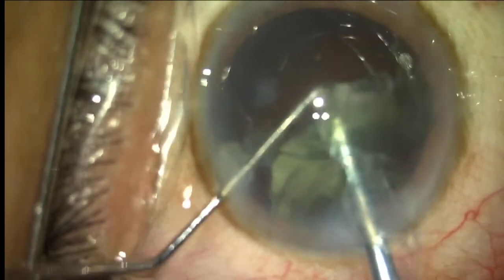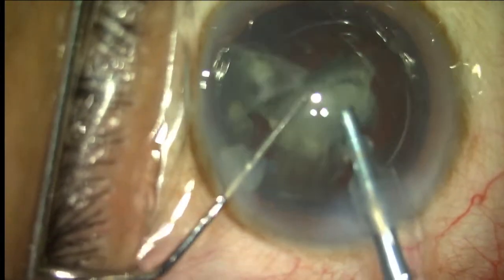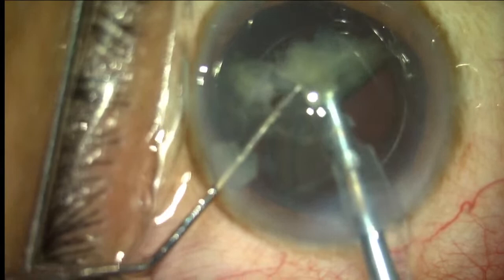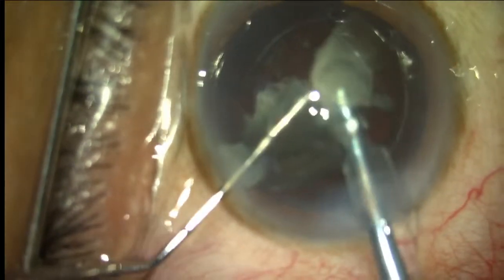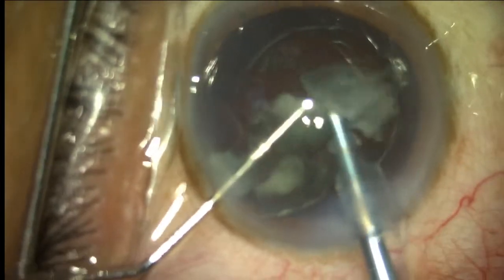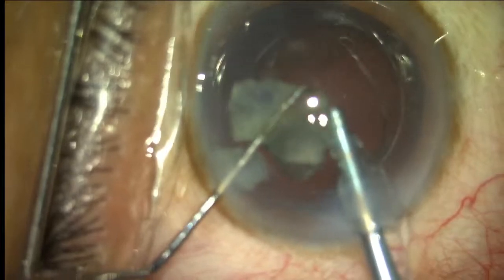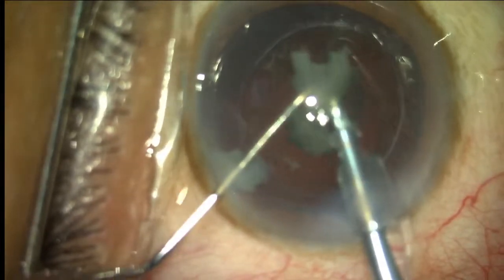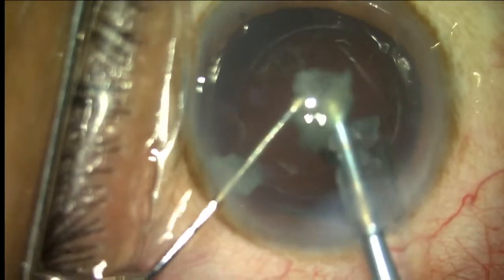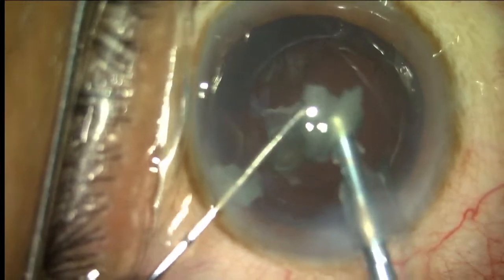I'm using this machine actually after a very long time, 1.5 years, but I'm still very comfortable using it. The chamber stability is excellent. Even though I'm using a 2.2 tip here, there is no shallowing of the chamber. But for the last piece, I would like to reduce the parameters. So I've shifted to the epinucleus parameters.